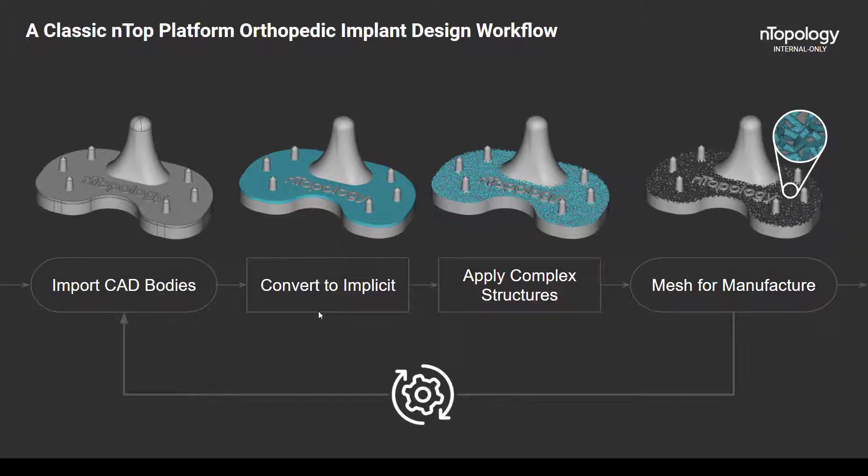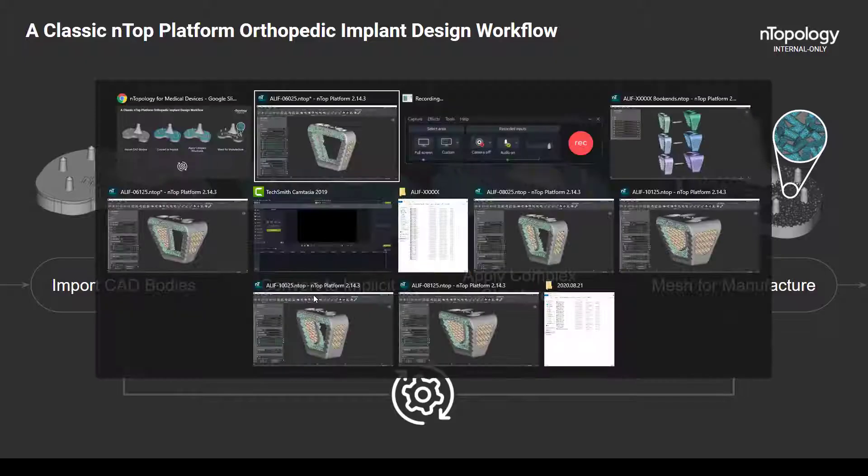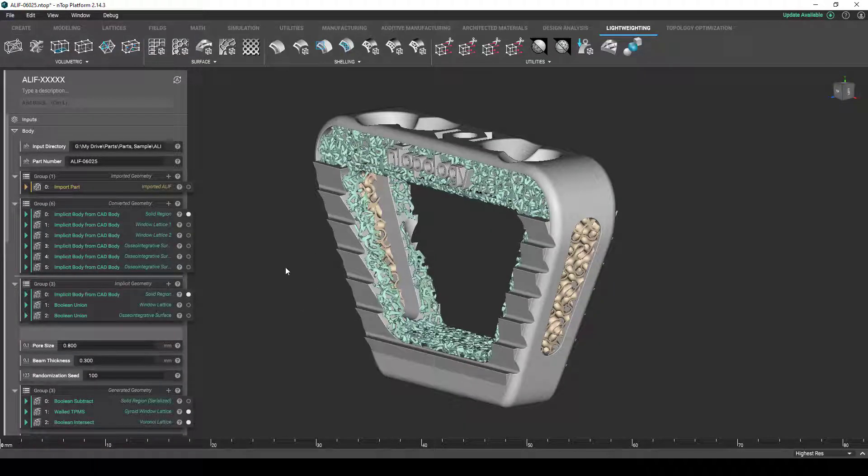In theory, we can just push all of our part configurations through this design workflow and just be done. However, nTop platform doesn't just create parts in a linear way. Due to the canvas-like nature of the design environment, multiple workflows can actually exist within this same nTop file.